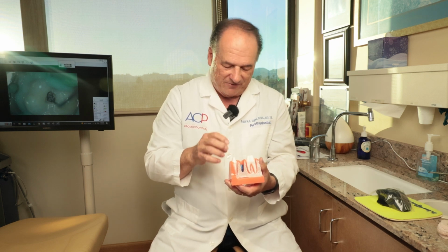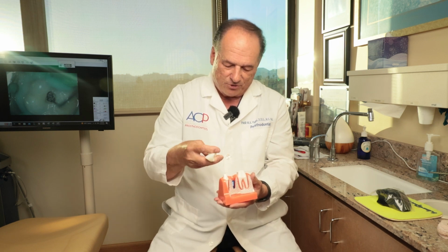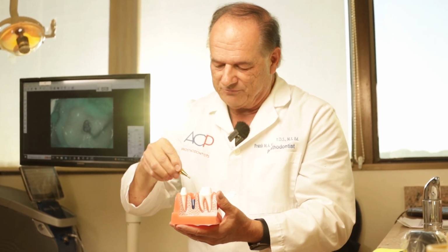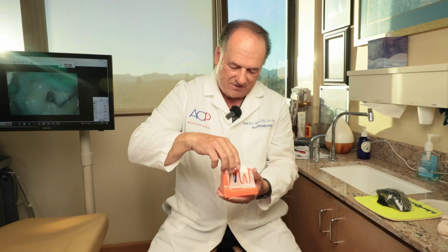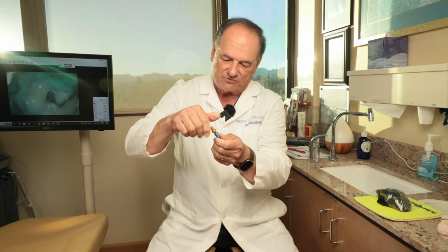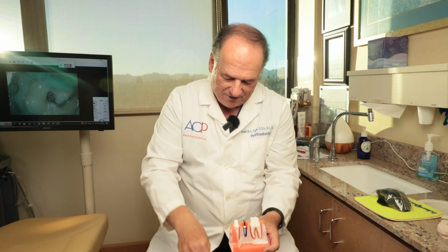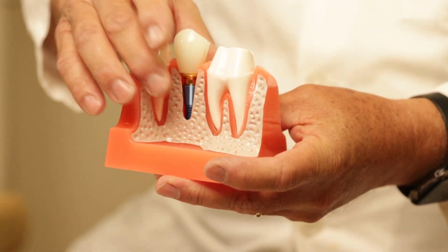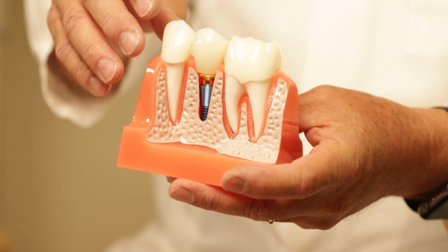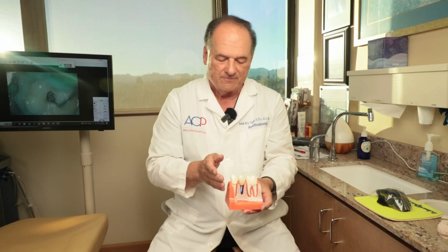However, what's the big advantage? The big advantage is, instead of having a bridge that connects teeth, you're able to have, through components, that is the beauty of an implant, the ability to screw in components of different configurations, and all of a sudden what used to be 3 teeth connected can now be separate.